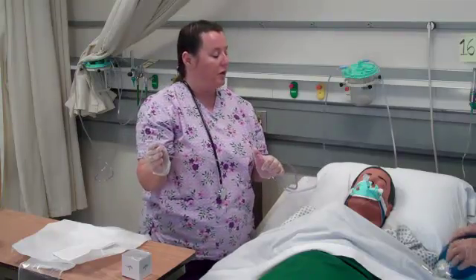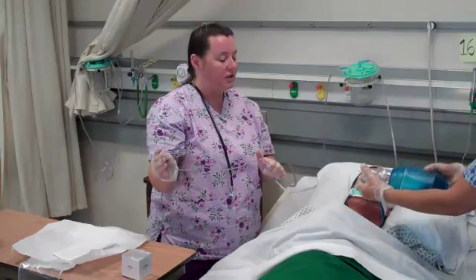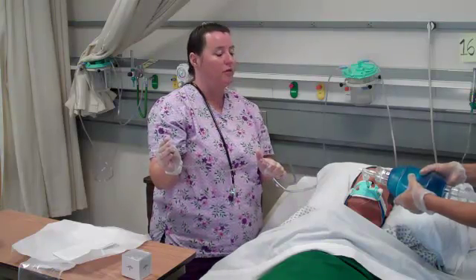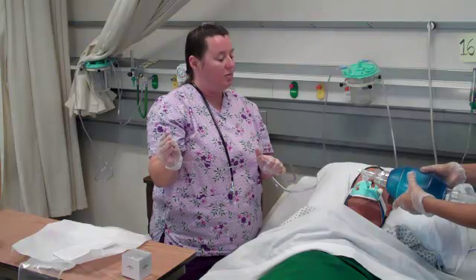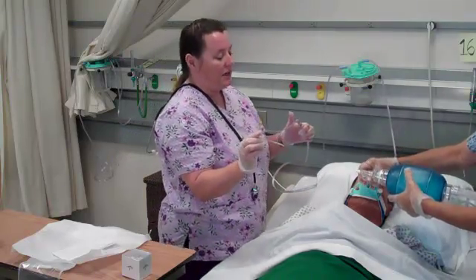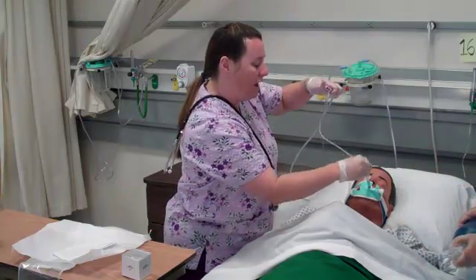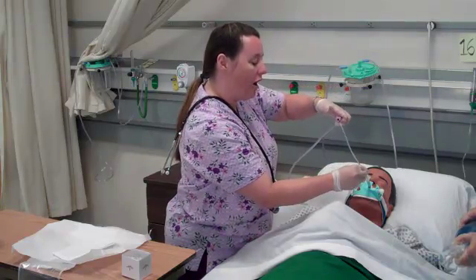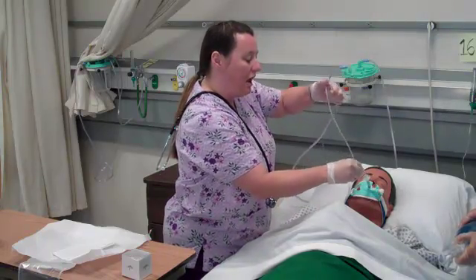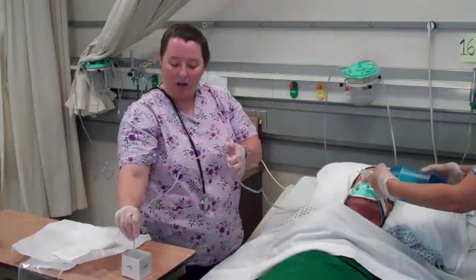I'm ready to suction, but first my assistant will hyper-oxygenate the patient — not hyperventilate — giving 100% O2 with the oxygen source on full flush for a couple of extra breaths. She then removes the patient from the oxygen source. Maintaining sterile technique, I go straight down the ET tube without touching the tube to my hand until I hit resistance or the patient starts to cough. I then pull up one to two centimeters and apply intermittent suction as I withdraw the catheter. I'll clear my tubing.